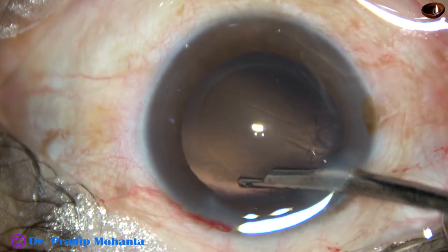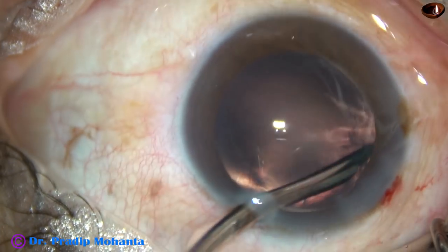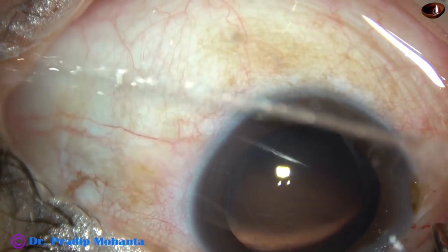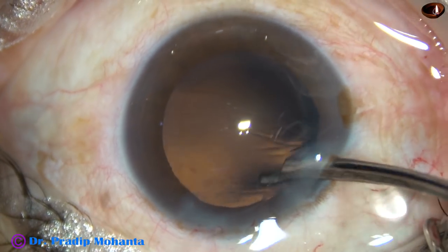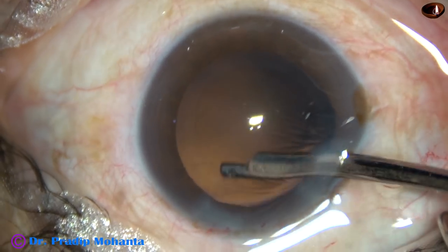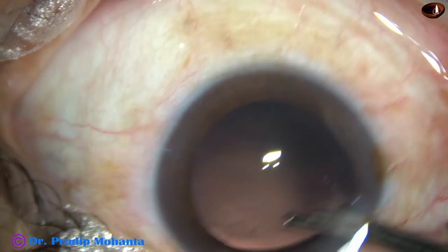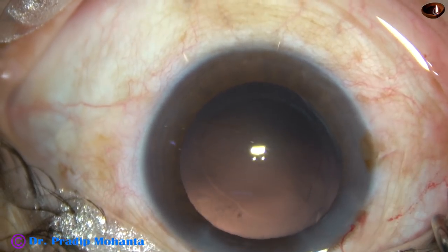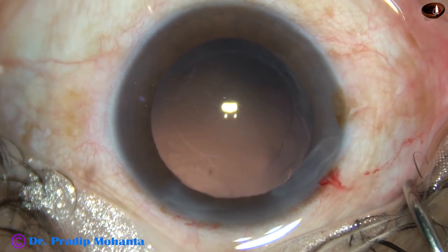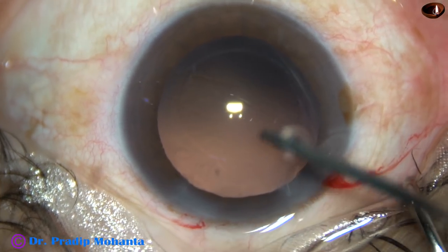In this case, cortical cleanup is being done by a 23G Simcoe. See how beautifully and how quickly you can remove cortex using this very simple instrument. Cortical cleanup has been done and now the posterior capsule can be polished by a fluid jet of the irrigating probe.